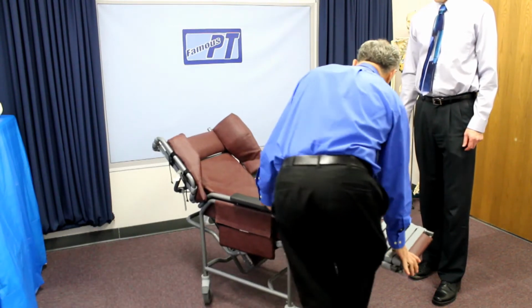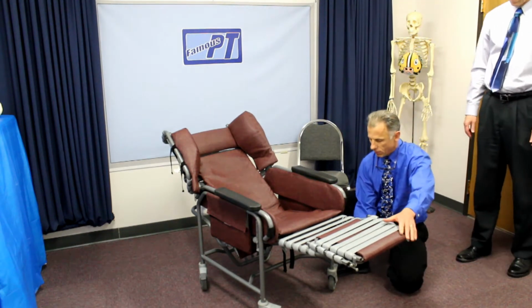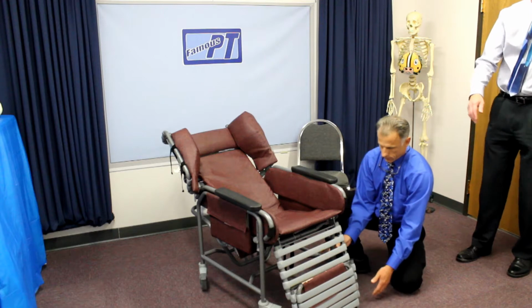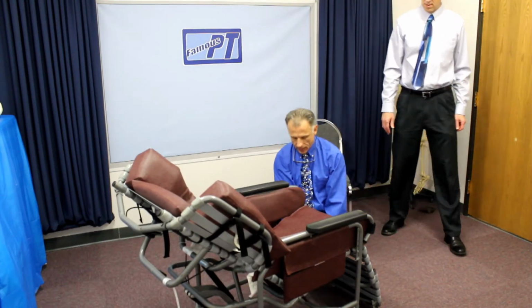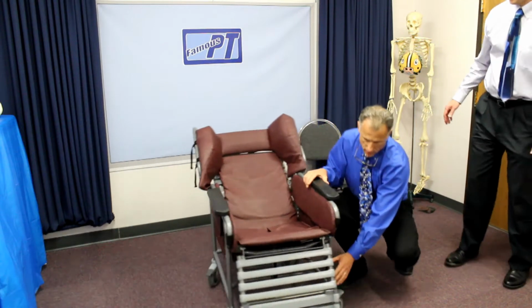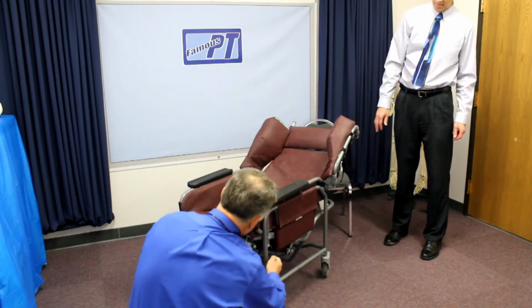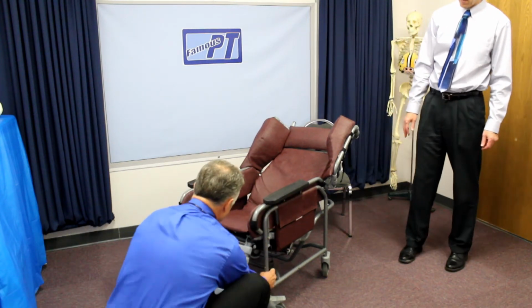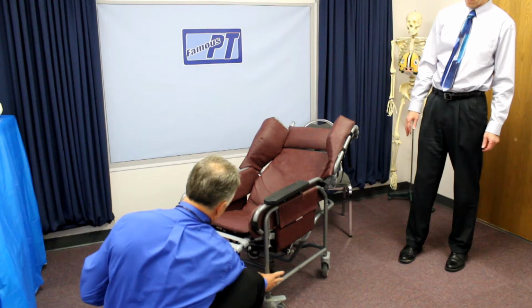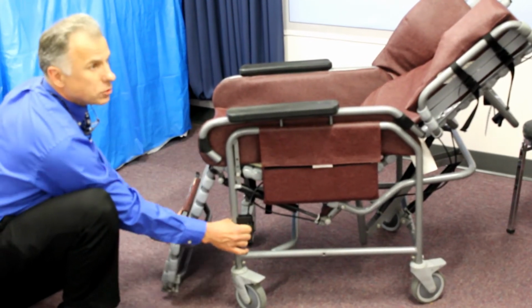All right, the leg rest is adjustable, and it has a lever right here. Brad, why don't you show that from the side? Oh, good idea. Here we go from the side. Well, actually, I'll go over here. You can see the lever right here. All righty. Okay, we got a little hydraulic system here, ram, that when you pull that in, it'll go up and it'll lock there. And it's easy to use. Yeah. You just got to know which one to do.